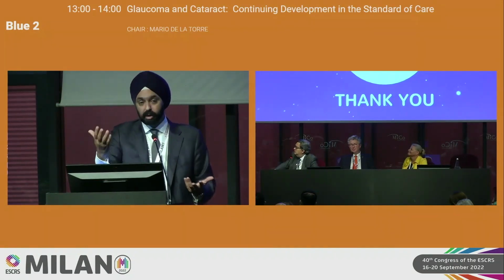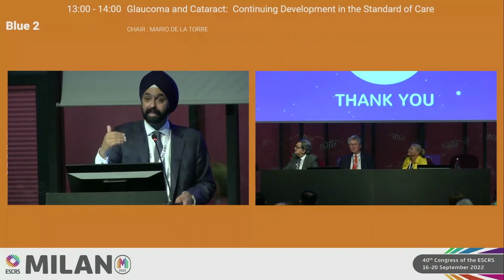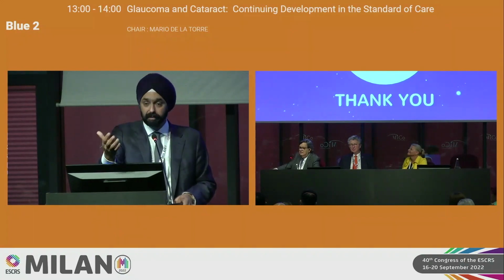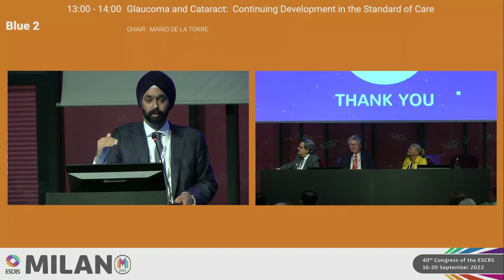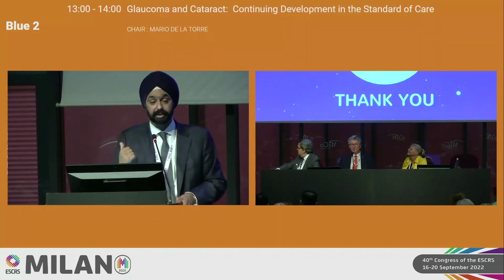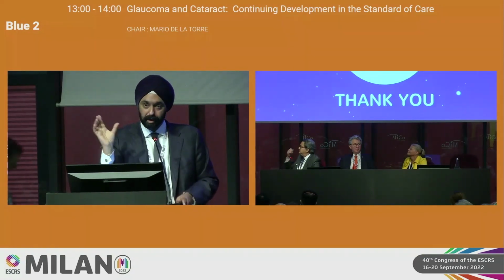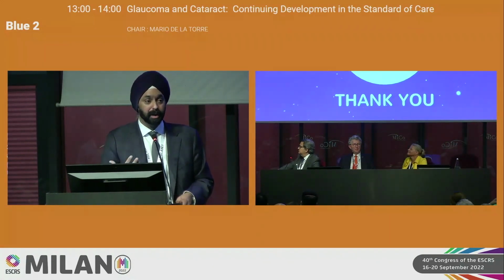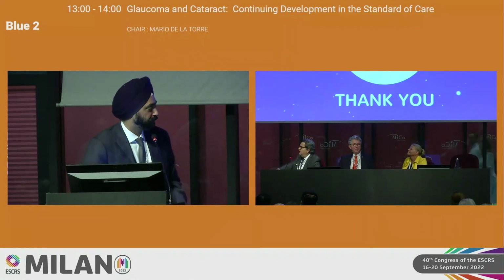We have something called the Infinite trial with Glaucoma showing us that those 3 stents have significant efficacy. And SLT can benefit. Now, you may have a little bit less efficacy in some patients, no doubt. But the safety being so high, it's still worth it to maybe get them off of 1 drop. It won't get you down to target pressure of 10, but it can get you some reduction as well. So it's worth a try, even after MIGS. Let's say you do your eye stent, or you do your canal dilation, your goniotomy, and you still have some area of TM left over, but the pressures are not where you want it to be, and the patient's not happy going on drops. A great opportunity to say, let's try SLT to augment what I did with my MIGS procedure.